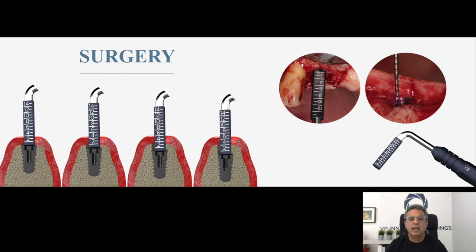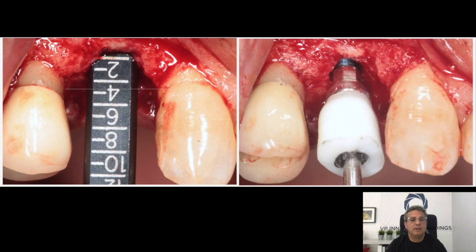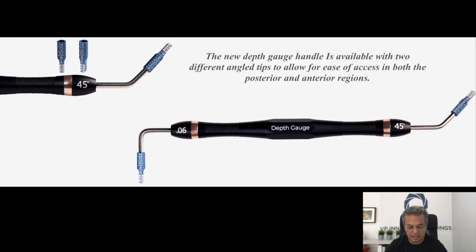It's all in millimeters. And it allows you to be able to determine depth of implant placement, soft tissue height, thickness, all sorts of different things, and they come up beautifully in photography. So you need to determine the zenith of the crown. You need to know if your implant is deep enough. And here is a good example of this. To know if you've got enough room for soft tissue so biology can do its thing. So it's a great little tool for all these specific points. This is actually the latest design, and I have a few of them here. And as you can see, they all work on magnetic connection, right? And it's really, really wonderful, and they come up beautiful in photography.